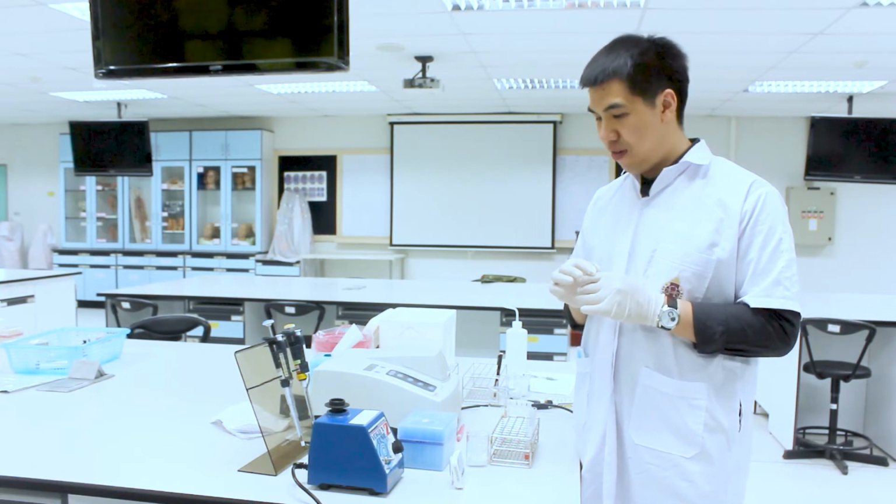In this laboratory, you can see we didn't prepare a standard curve because we used the calibrator, so the way of calculation will be different. We will discuss that later. For now, we have finished the 5-minute incubation step.